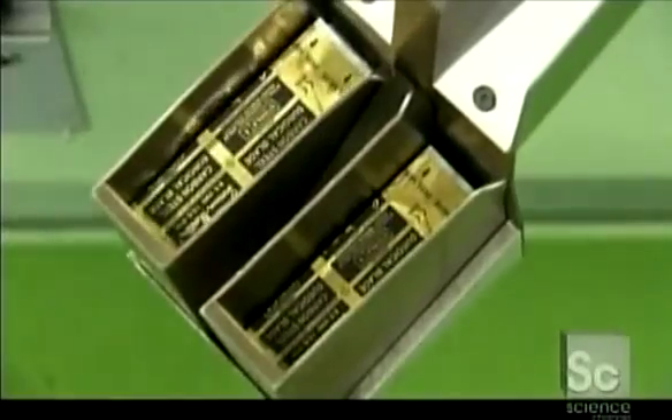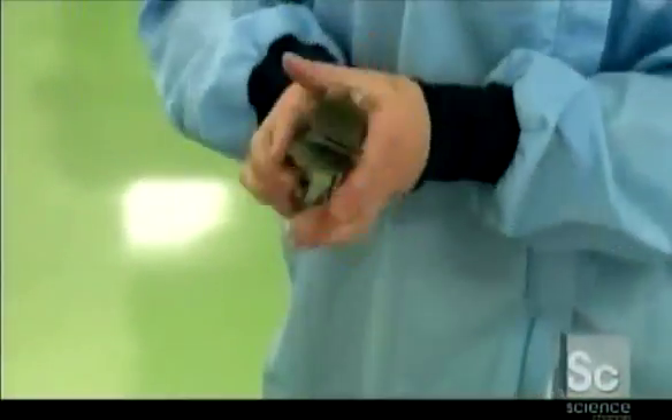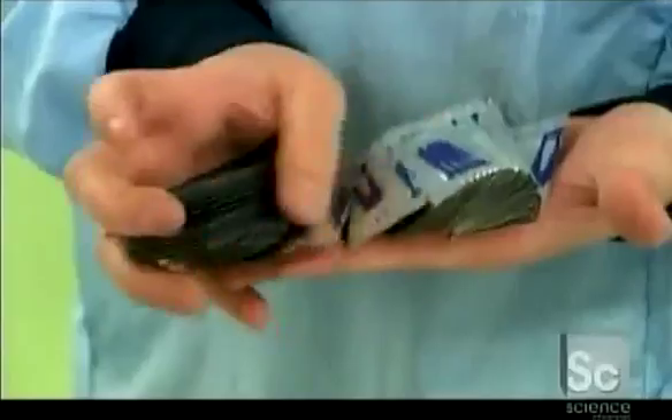As the blades come off the packing machine, an inspector does one last quality check. Then he counts the blades and boxes them.